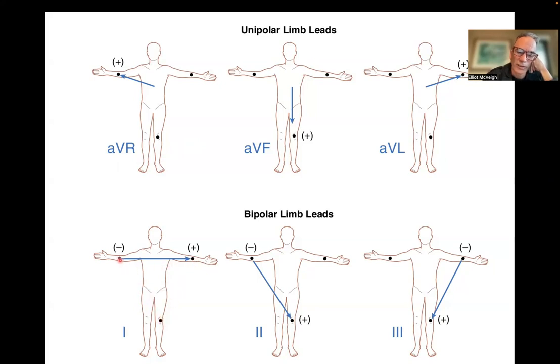When you measure the voltage between two leads as a function of time, when the heart contracts, there is a voltage produced in the myocardium itself that has a gradient across the myocardium, that essentially maps by conduction to the surface of the patient and projects, if you can imagine, a picture of the relative voltage over the whole surface of the patient. And so you measure that picture at these three points and then look at differences.